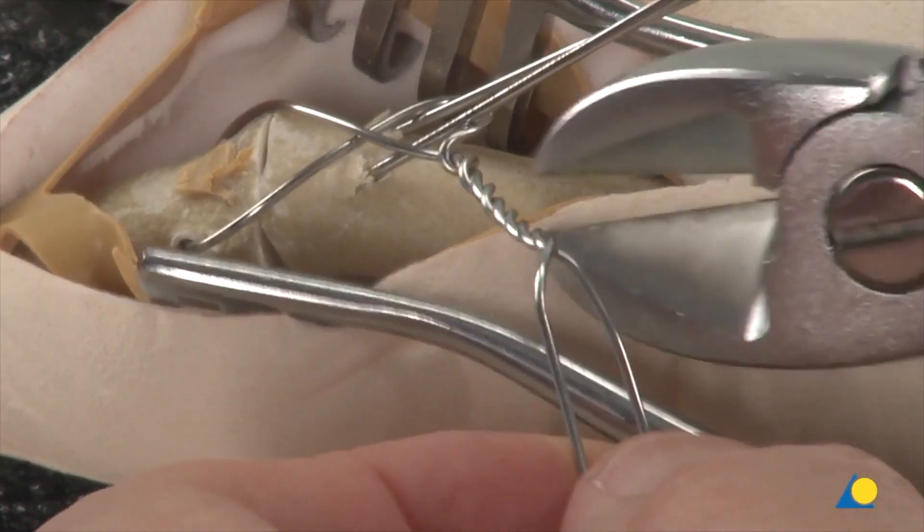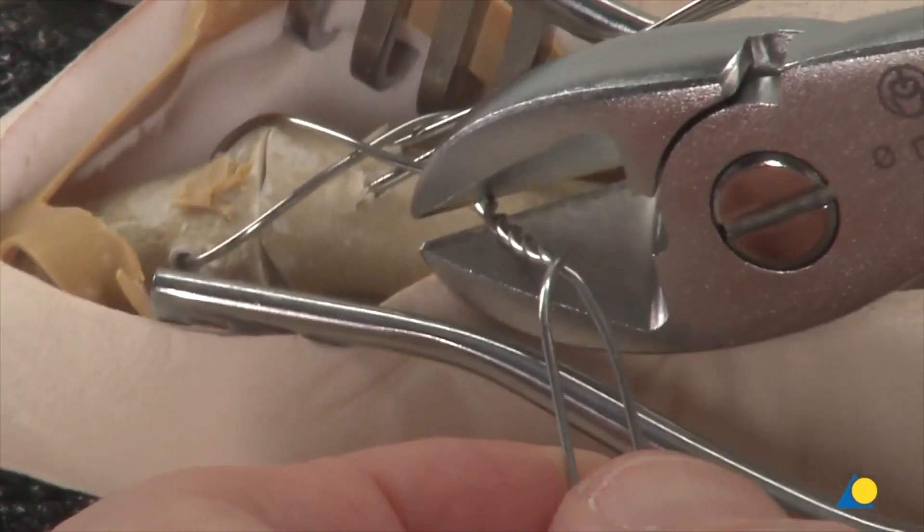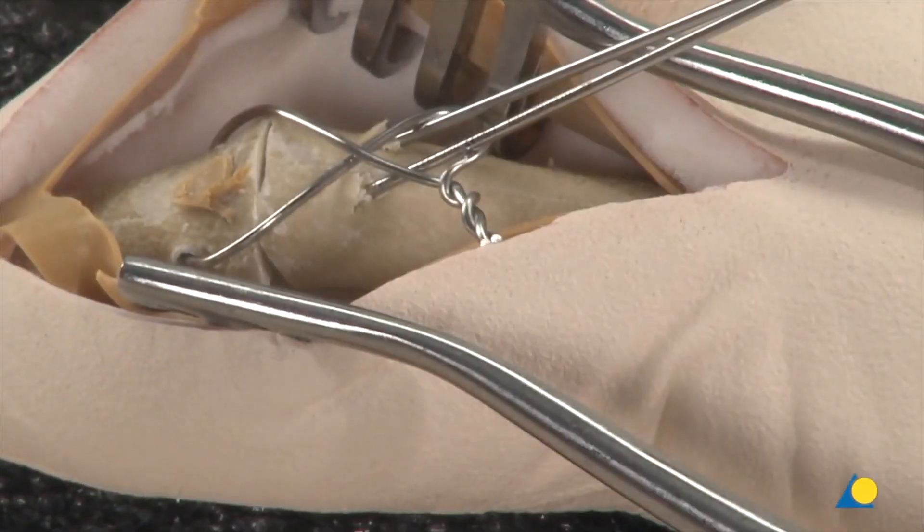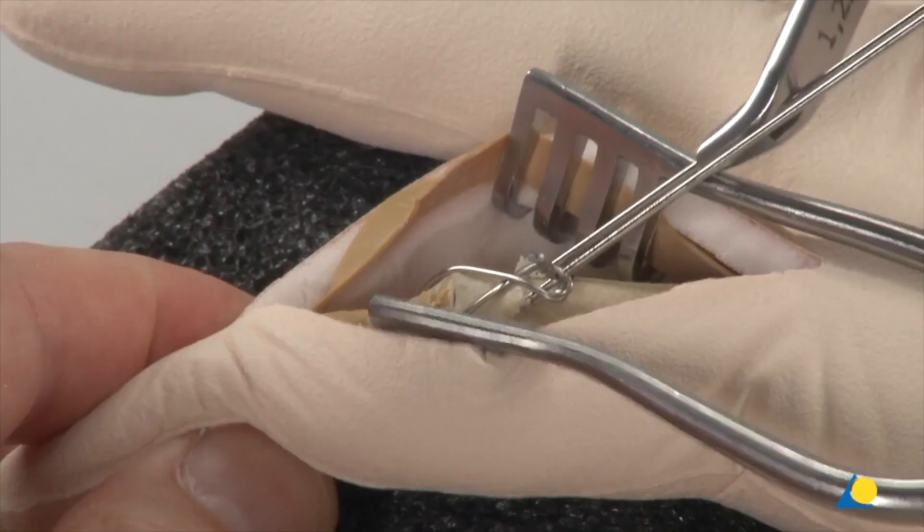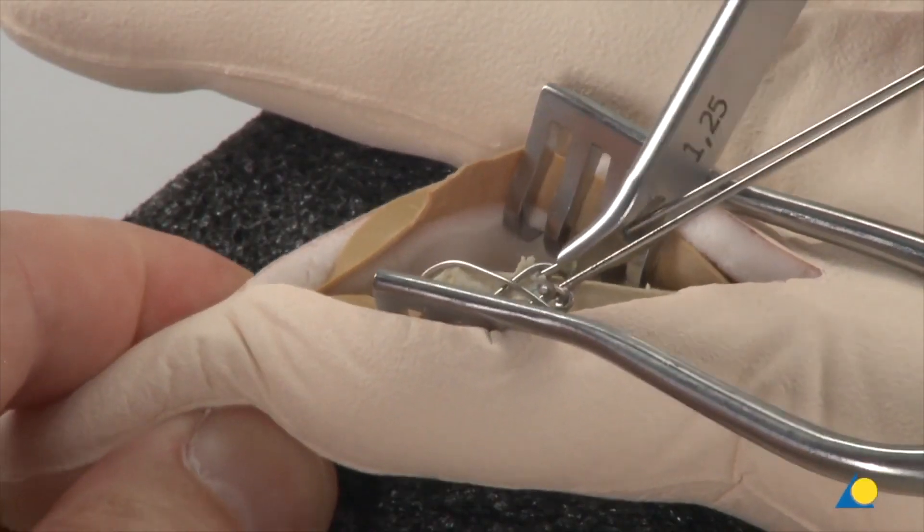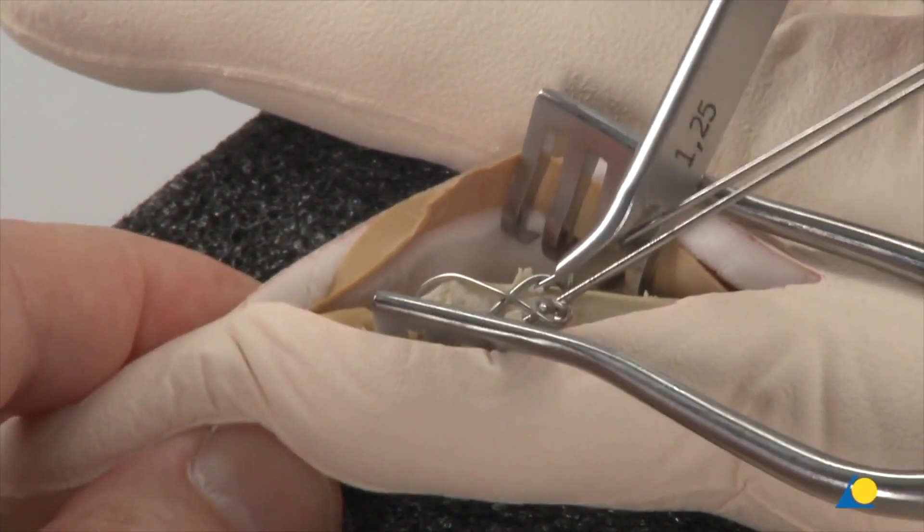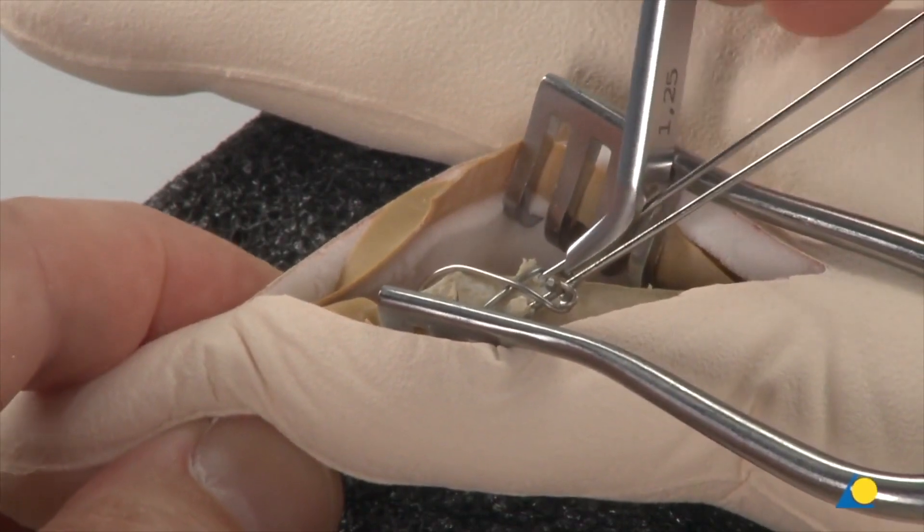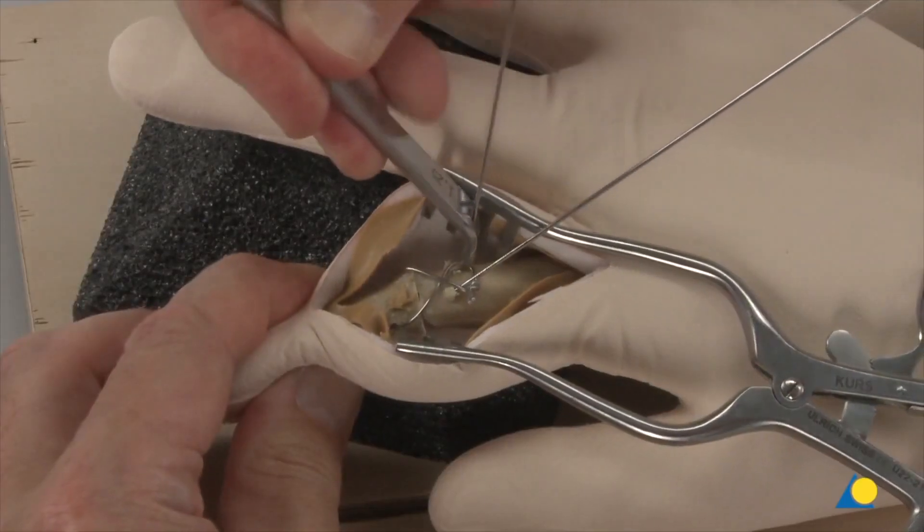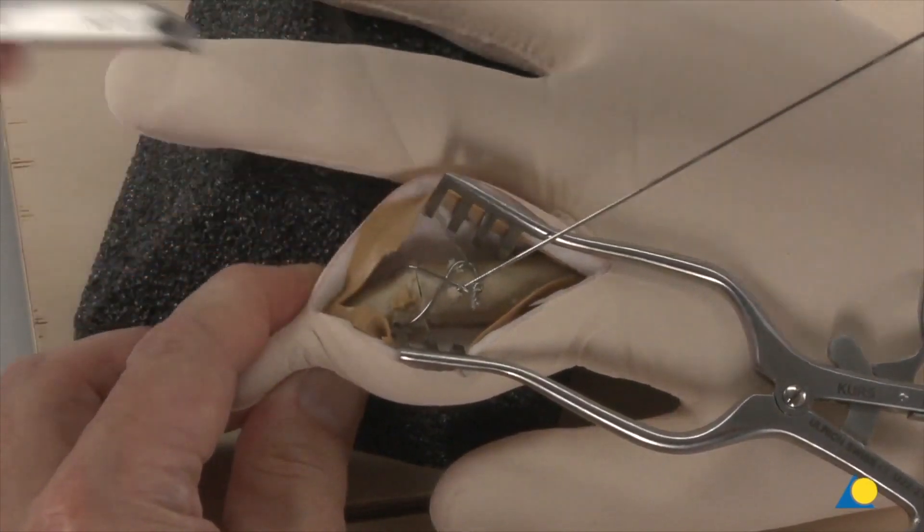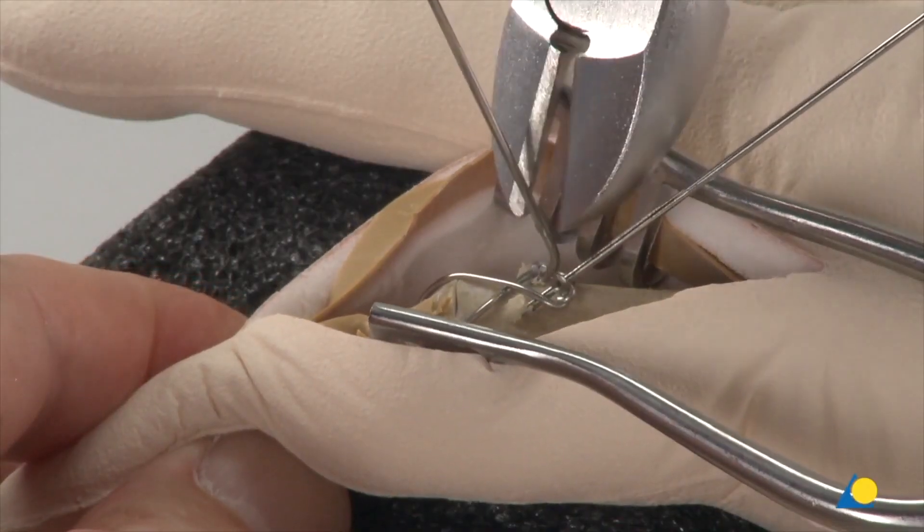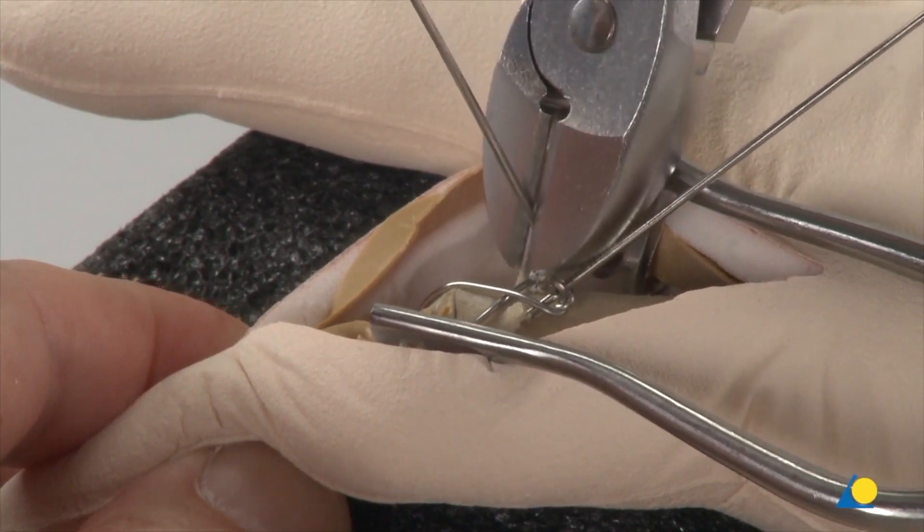The wire ends are then cut with the wire cutter. The K-wires are bent with the bending iron. The wires must be shortened with the wire cutter and bent away to the side.